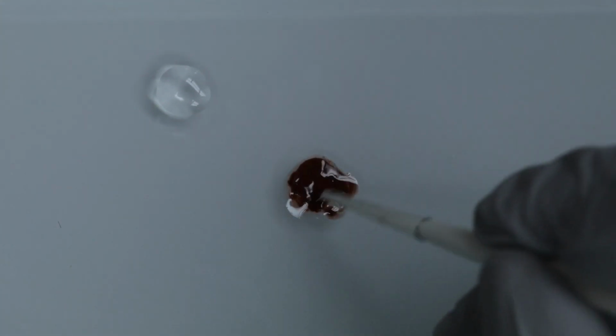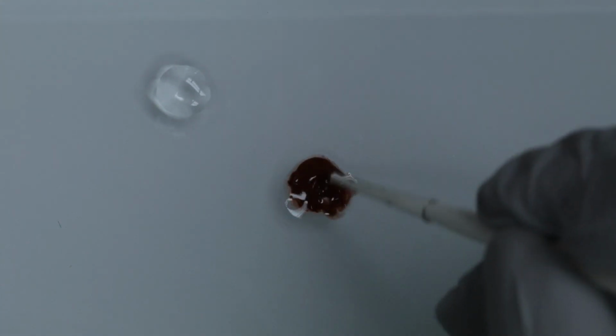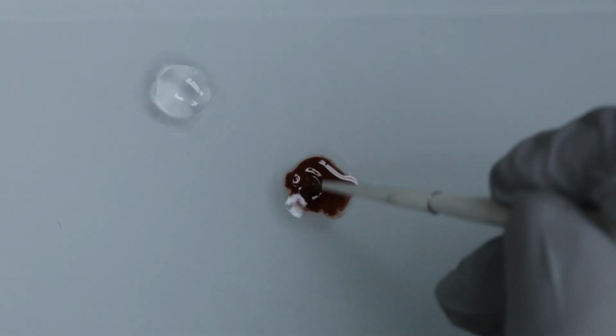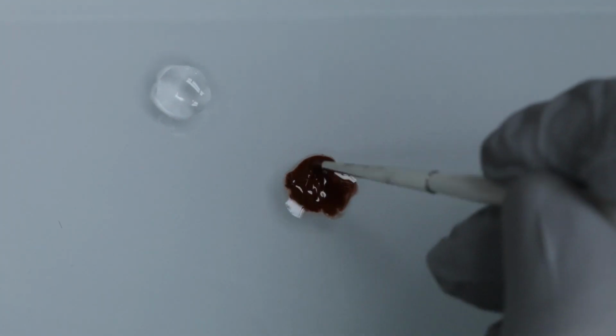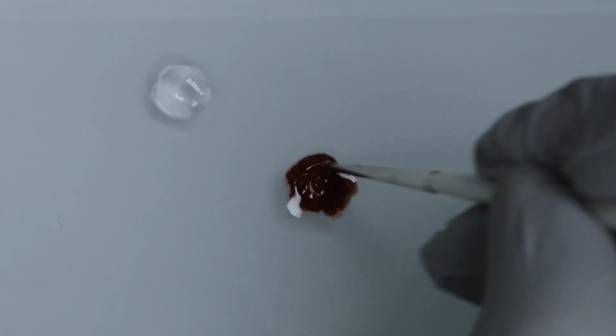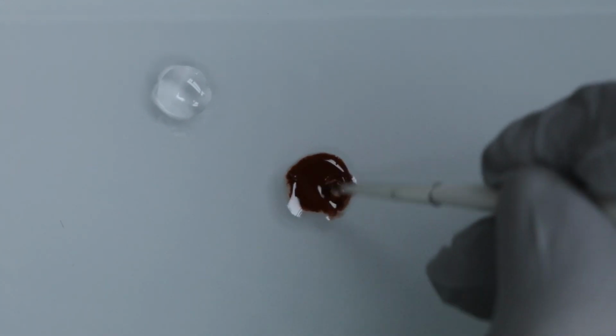And this stain is actually fairly runny. I have this liquid out here to dilute it if I needed to, but it's pretty runny, so I don't think I'm going to dilute it any. I'm just going to mix it up really well here so it's all kind of incorporated.